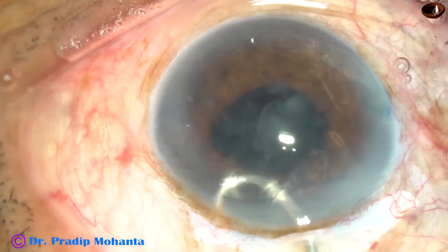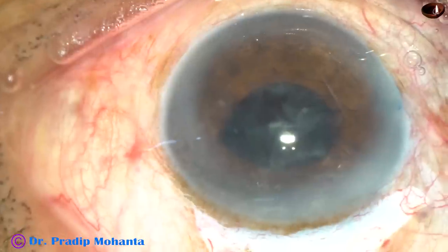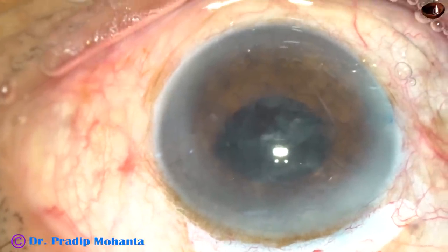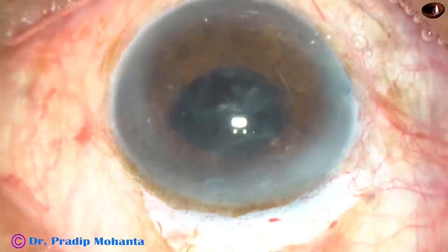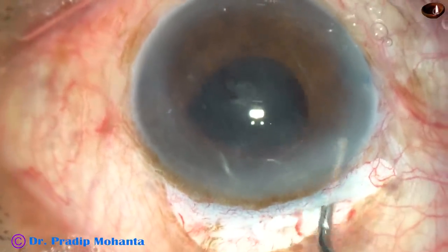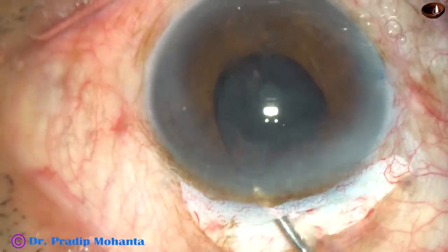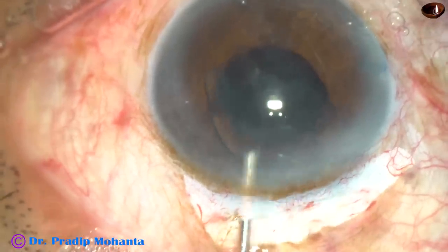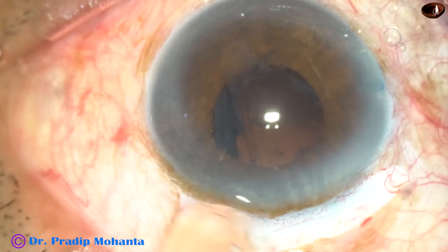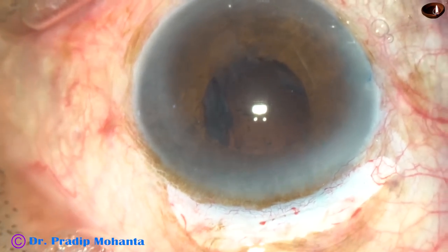There is a lot of epinuclear material in this case. Use viscoelastic substance and do viscoexpression — inject visco on either side, both right and left. Now depress the posterior leaf and the visco will come out. When you depress the posterior leaf, you can inject some more visco.